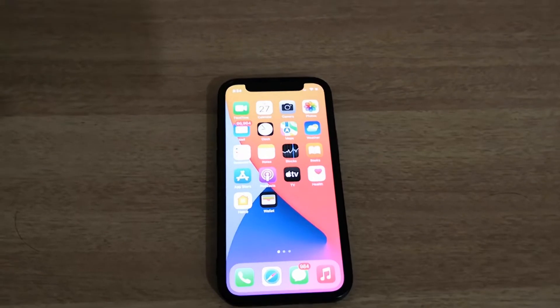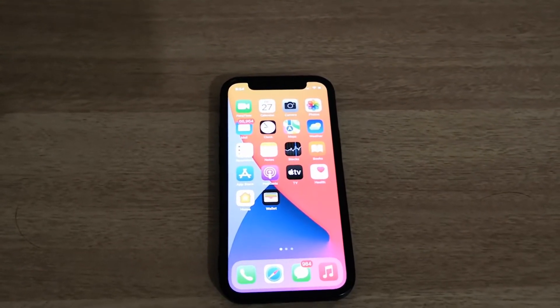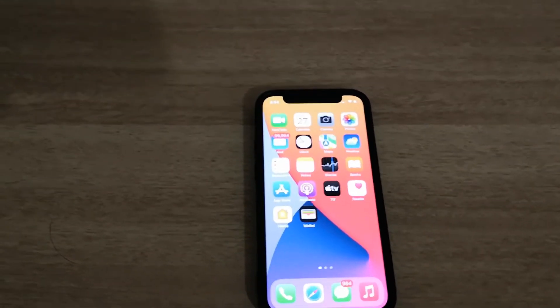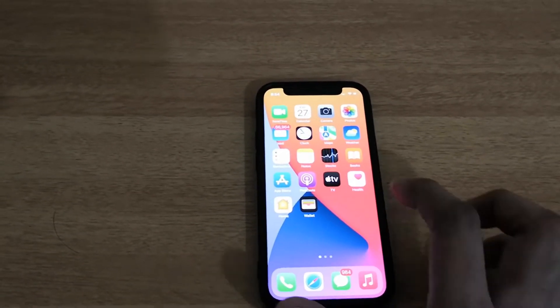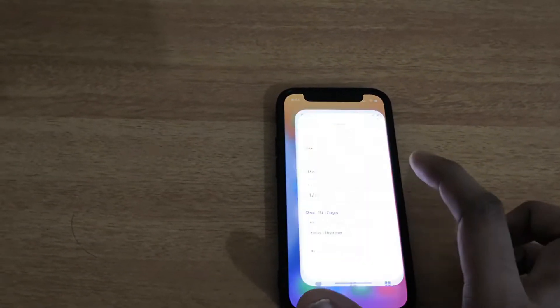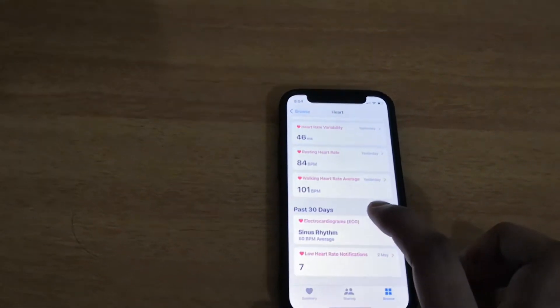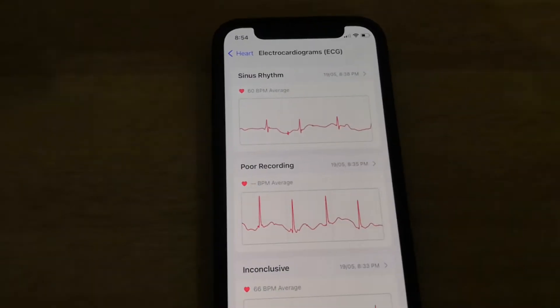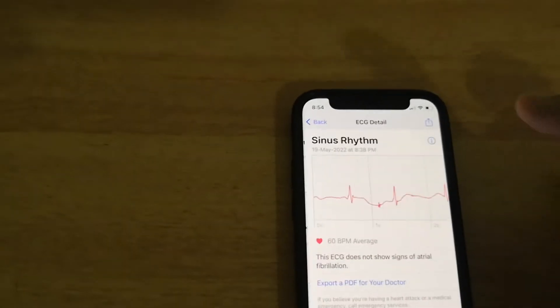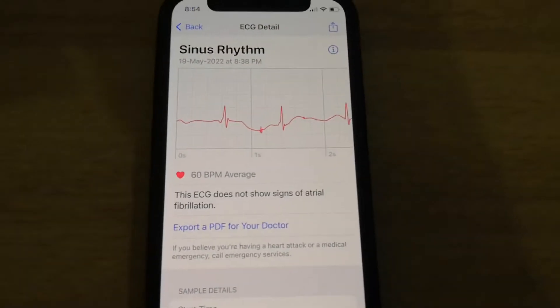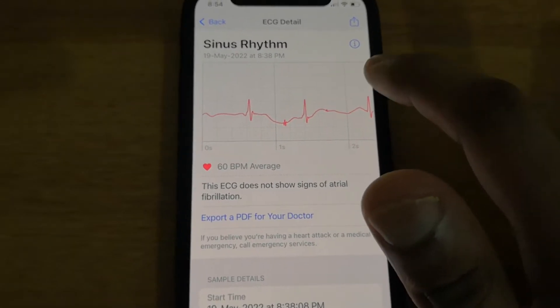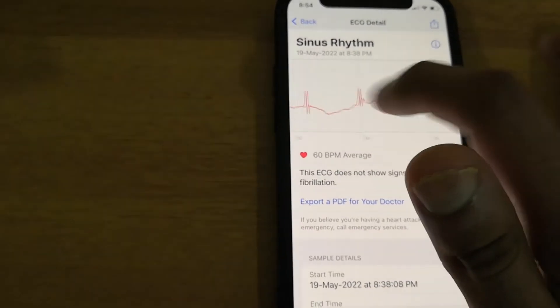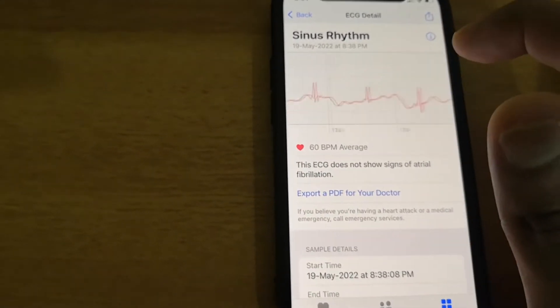Hello everyone, this is Mr. Noob. Today I will show you how you can interpret the results of an ECG taken from an Apple Watch. You can take the ECG in your phone, and after taking it, if you come to Health you can see the ECG recording here. As you can see, if I try to open this, this is how my ECG looks like. But now I'm not sure how or what I can interpret from this ECG.